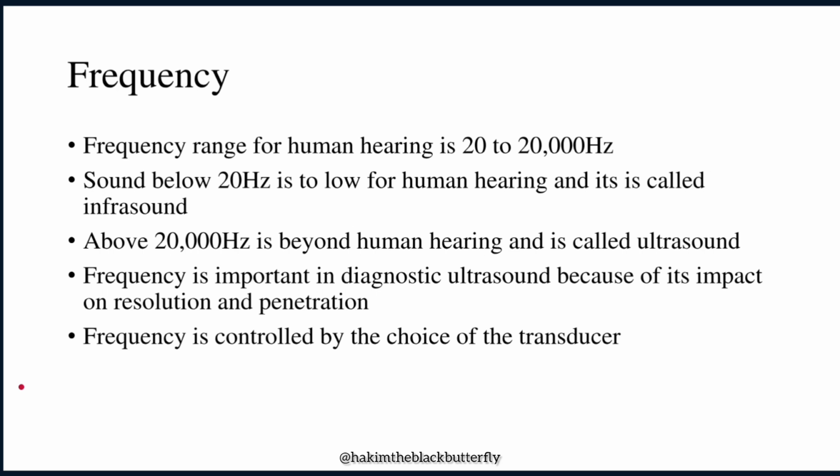So when the frequency is high, it is equivalent to rubbing your palms very fast. So at high frequencies, instead of these molecules transferring energy deeper, they are actually converting it into heat. So the energy becomes absorbed so fast because it is being converted into heat. Whereas low frequency is equivalent to rubbing your palms slowly. The conversion of energy into heat is not as high as at high frequency. So the beam does not get absorbed so fast as in high frequency, so it can get deeper.